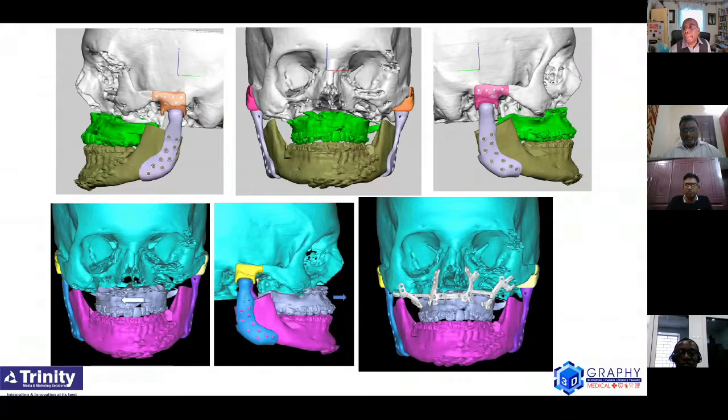And another innovation John took up at this stage, on a combined note, if I can add, is that we went in for a titanium bar in the upper jaw. Remember, this patient was already operated once for fractures in the upper jaw. However, since we were going in for rehabilitation of the lower jaw, she had a cant of occlusion, or the upper jaw had slid down on one side. So going in and removing these older plates and fitting in newer plates would be a challenge for us because there was lack of bone there.